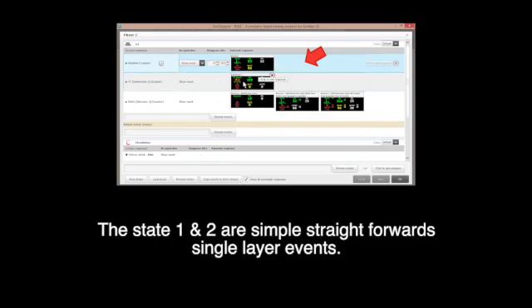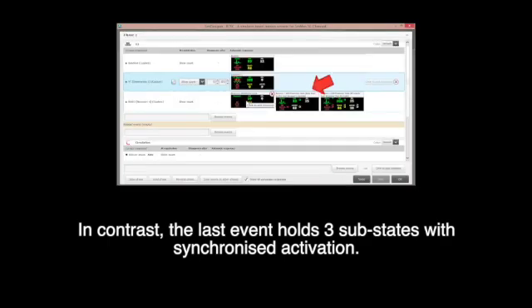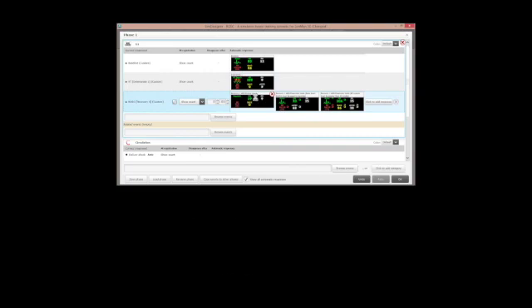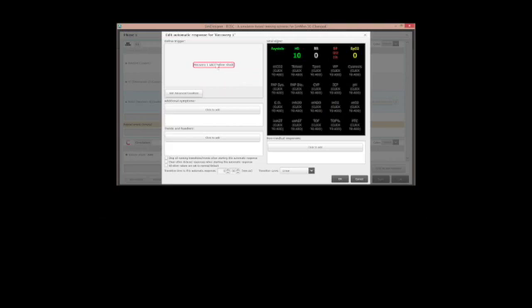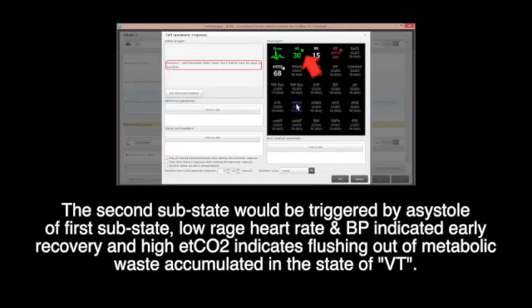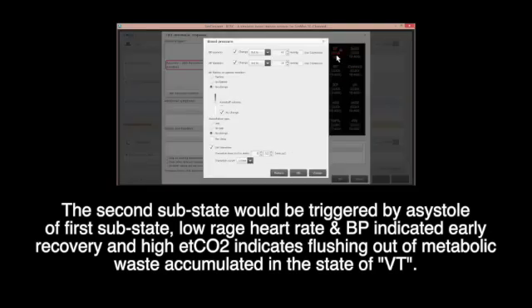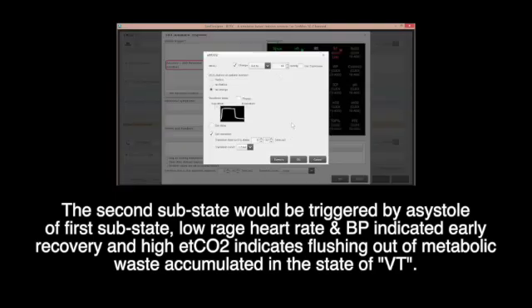Overview of programmed ROSC: states 1 and 2 are simple, straightforward, single-layer events. In contrast, the last event holds three substates with synchronized activation. This coordinated manipulation begins with a click on ROSC and defibrillation detected by the system. The first substate gives commands of post-defibrillation ECG flatline with low parameters to allow subsequent regain of each parameter. The second substate is triggered by the asystole of the first substate — low range heart rate and BP indicate early recovery, and high ETCO2 indicates flushing out of metabolic waste accumulated during VT.